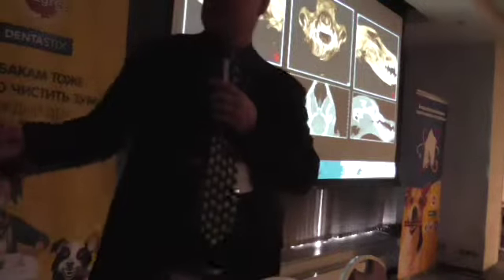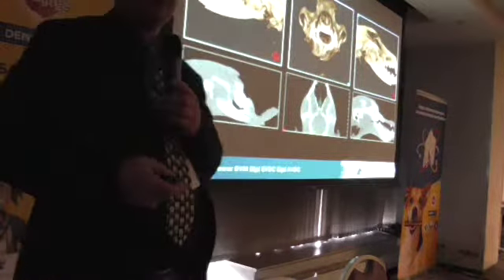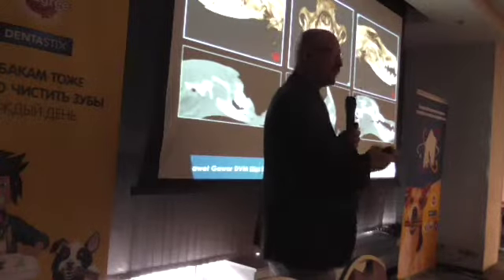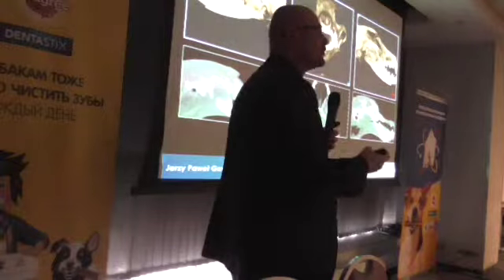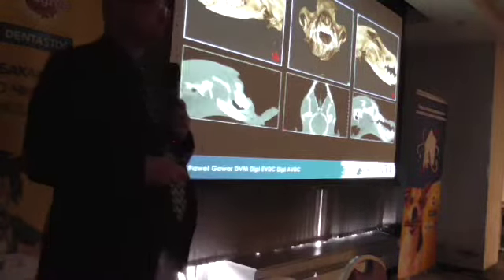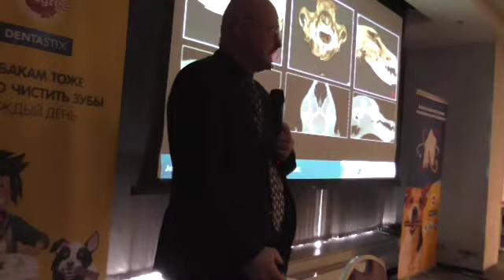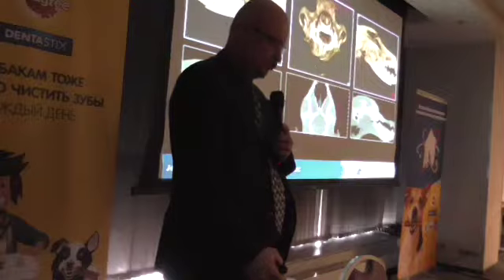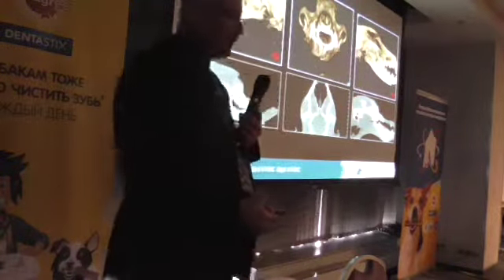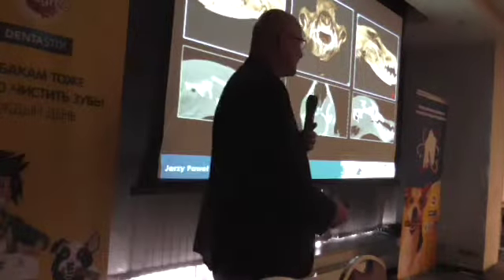And then we can collect the data, and you see that you need time to read it. This is what I haven't said yet. You have a wonderful study, and you need 45 minutes to read it. After that you get certain information, and this is where it gets interesting. You need to interpret these pictures, and reading such scans takes 45 minutes.